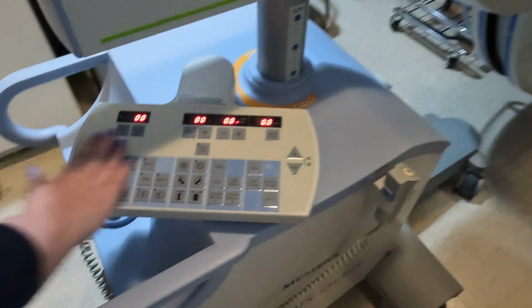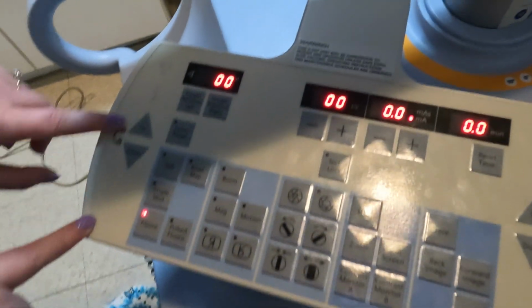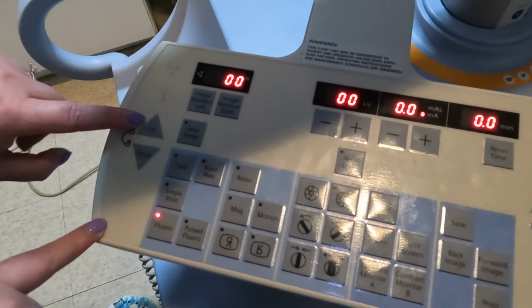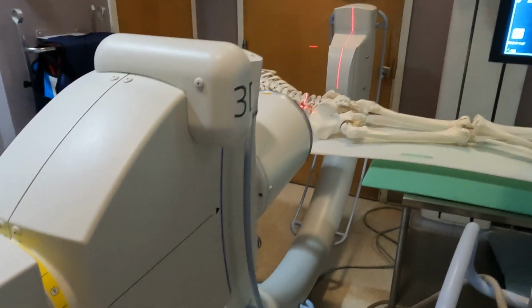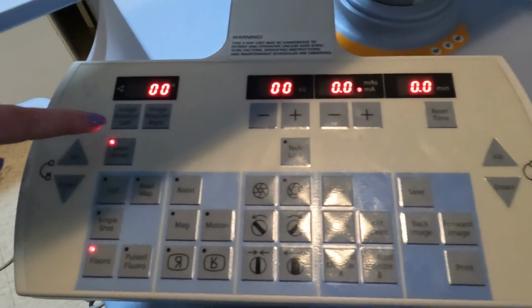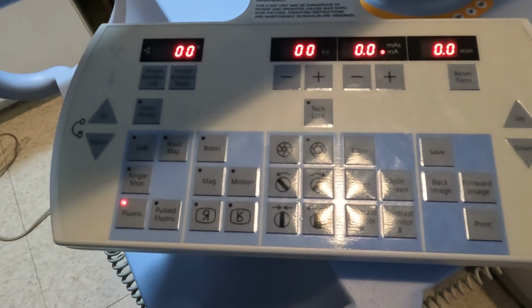So we come over to the C-arm. On this panel here, this is kind of the panel that runs the C-arm. We have all types of buttons here. So if we need to move our machine up or down, we use up and down here. The laser is built into the C-arm. So if you want the laser, you can click it on and it turns on the machine. The laser does have a timeout timer, so if for some reason you notice that your laser is not on anymore, don't worry, because you can turn it right back on.